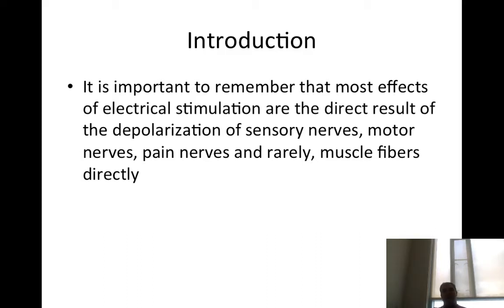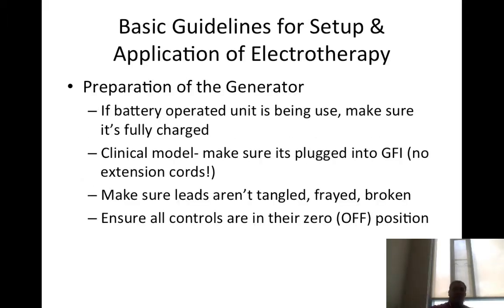We're not taking away the agent or issue that is causing the pain, the source, if you will, of the pain, right? That will come more with an evaluation and better techniques as you go through the training program here at George Mason. But we can at least manipulate the machines to help decrease their pain, right? To at least start at the initial injury management or intervention or rehab portion.